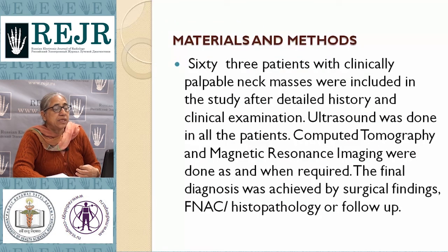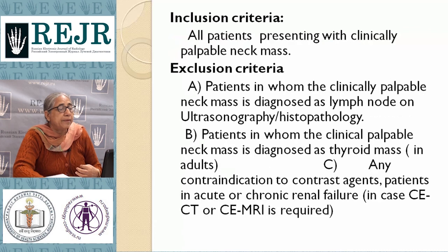63 patients with clinically palpable neck masses were included in the study after detailed history and clinical examination. Ultrasound was done in all the patients and computed tomography and MRI were done as and when required. The final diagnosis was achieved by surgical findings, FNAC, histopathology or by follow-up.